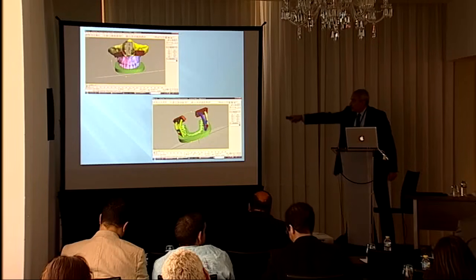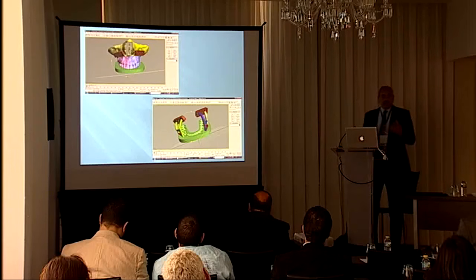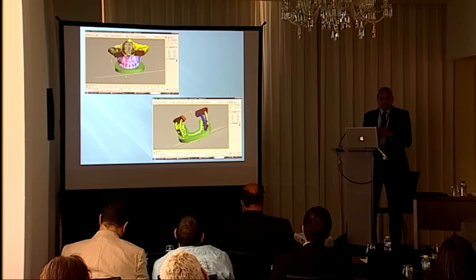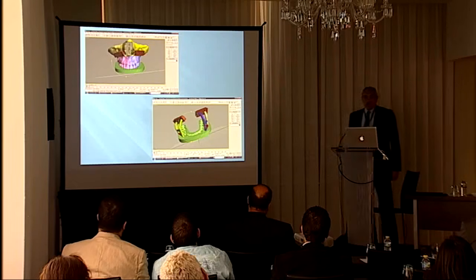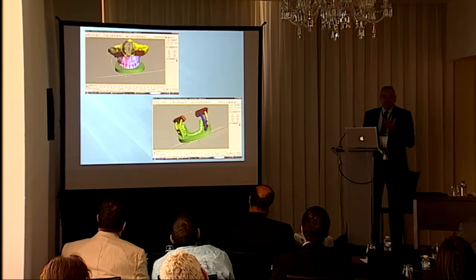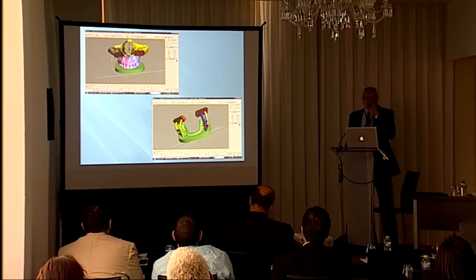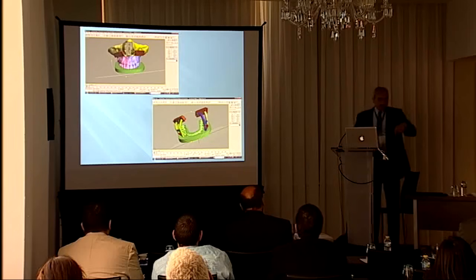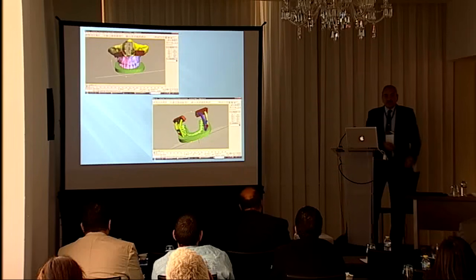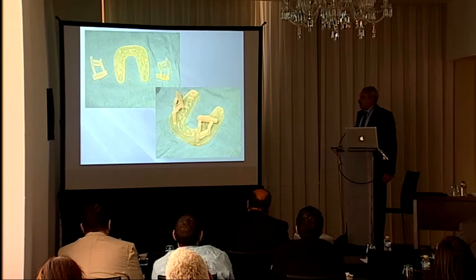Here we do a box, and on this box we do what we call, in the software, Boolean operations. We ask the computer to remove the teeth from that box, so it ends up like a wax bite that fits in place. And these arms fit on the zygoma. We'll see them now. And the connecting arms, when having holes, when they fit inside each other, that denotes the maxilla in the exact planned postoperative position. The shape of the splint in pieces.